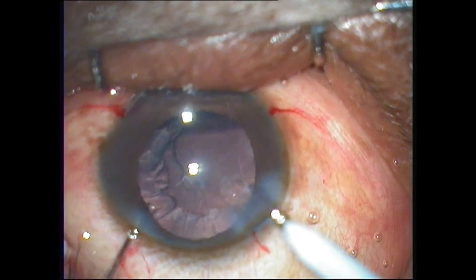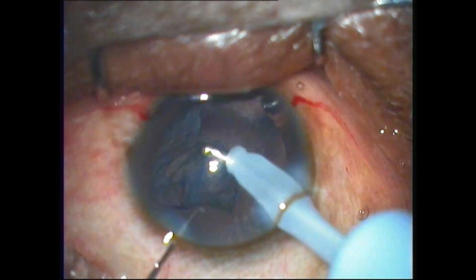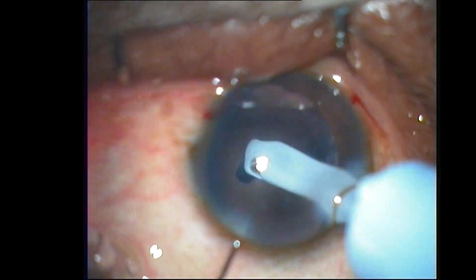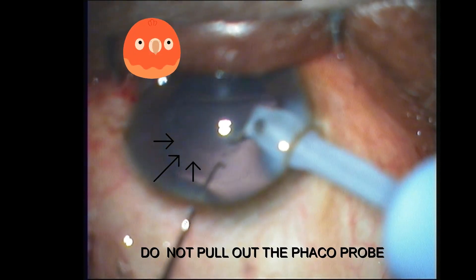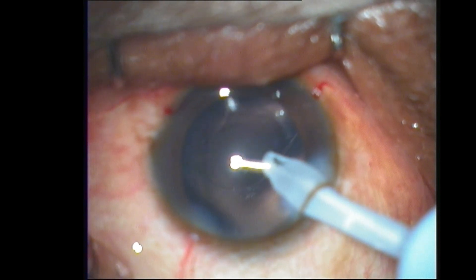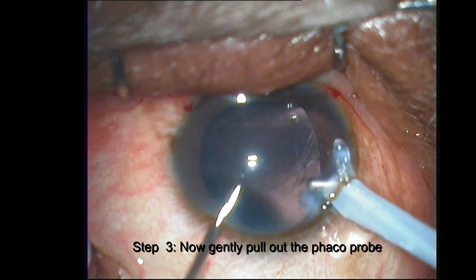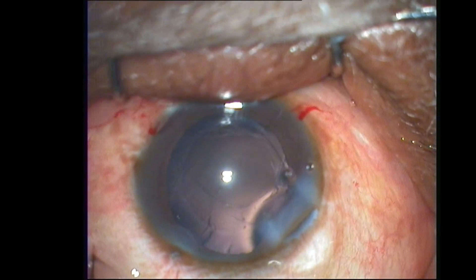Example one: after cortical aspiration with a coaxial I/A probe, I perform overzealous polishing of the posterior capsule, which leads to a rupture of the posterior capsule. The most important thing is not to panic and pull out the probe. Instead, initiate a visco fluid exchange in three steps: step one, turn off the irrigation; step two, fill the anterior chamber with viscoelastic via the side port; step three, gently pull out the phaco probe. In spite of this, there is a blob of vitreous presenting at the clear corneal lip.